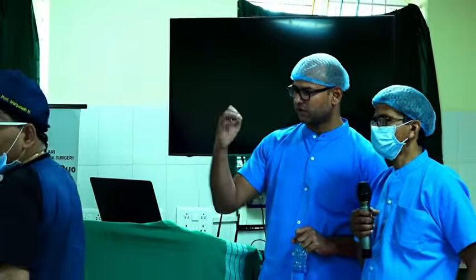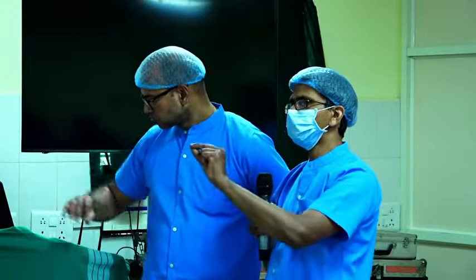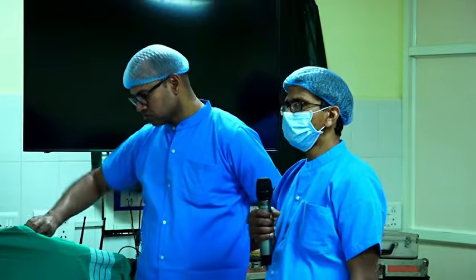Diode laser we have used. Diode laser, especially in the larynx, only if at all for bilateral vocal cord palsy procedures, with contact laser. And hemorrhagic polyps, they do it as daycare also. You can do it with a working channel bronchoscope. And second, a diode laser is helpful when you are doing obstructive sleep apnea surgery, for UP3 laser. That is very good. Diode laser is a very good tool.